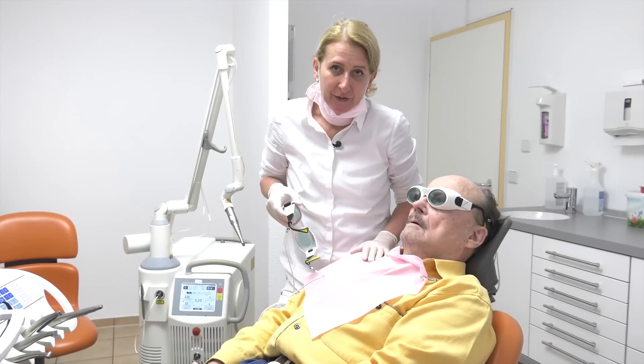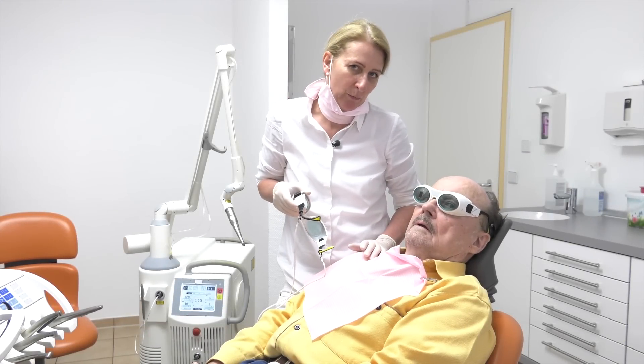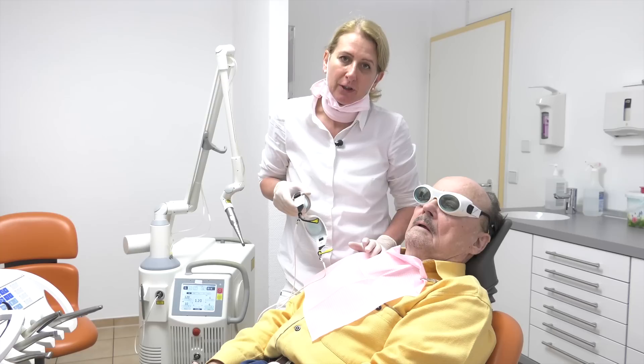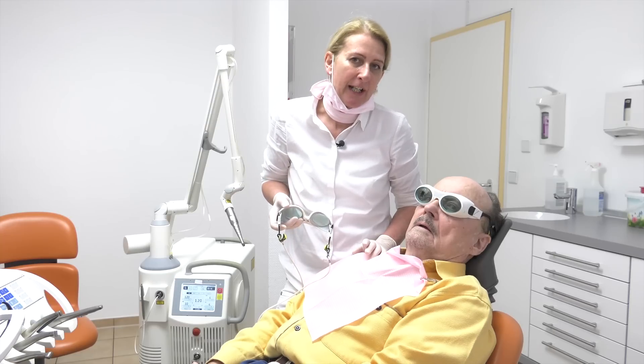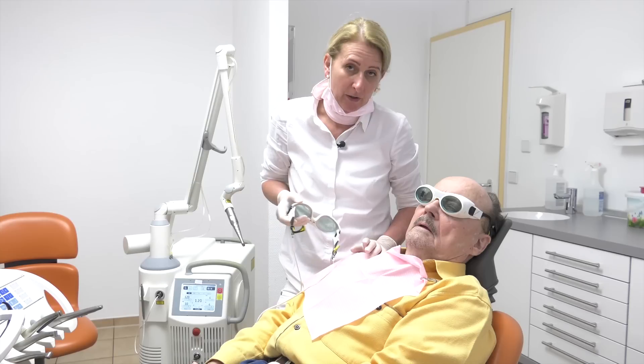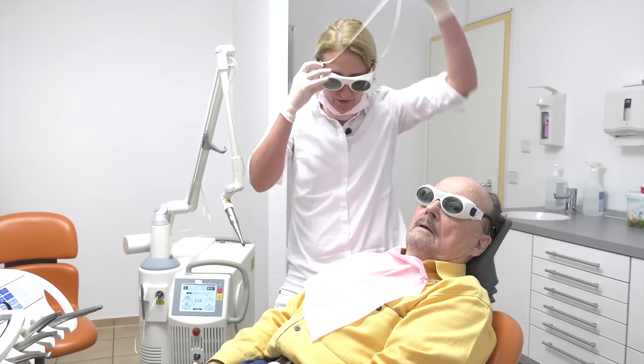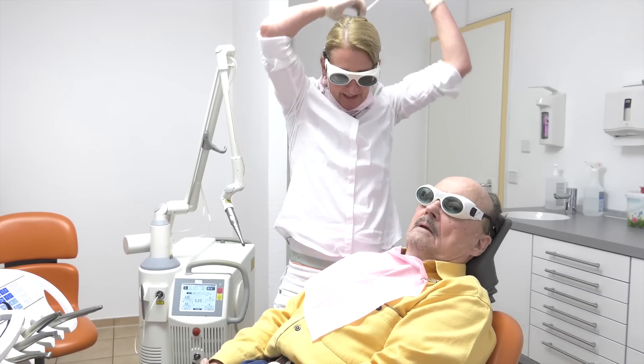Just let us start. In this kind of situation, the patient normally would get an artificial crown. When we use the laser, we can avoid this kind of treatment. Just let us start to prepare with the laser. And, of course, we all have to use the laser safety glasses.